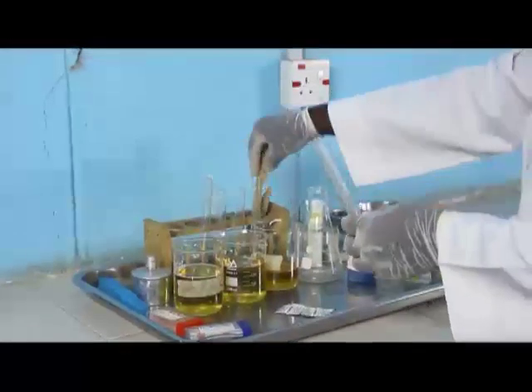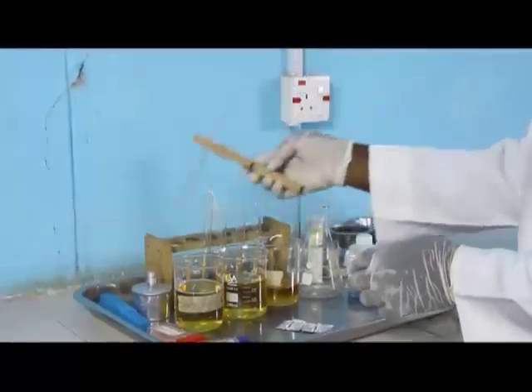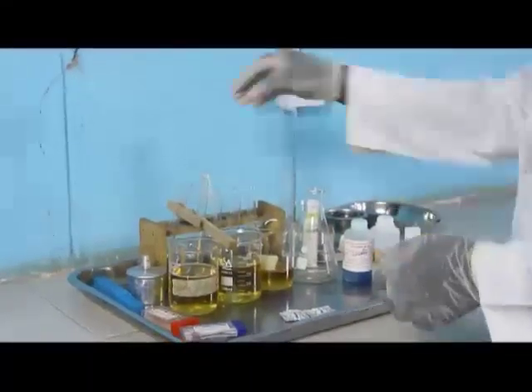Clinitest tablets: 2 or 5 drops of urine, or as per the manufacturer's directives, and 10 drops of water are measured with a dropper into a test tube.